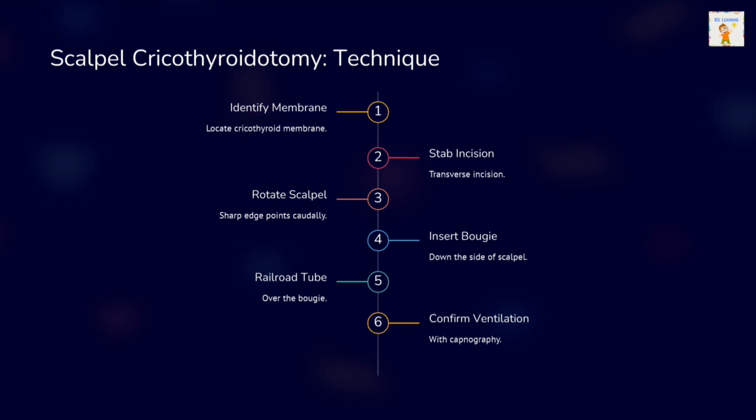So we push the tube, inflate the cuff, and start ventilating. This will give you some time, a few minutes to hours, to get a surgical airway in place. Remember, in an emergency situation, surgical tracheostomy or percutaneous tracheostomy can be very dangerous, and it is generally not encouraged unless you are very well trained in that.